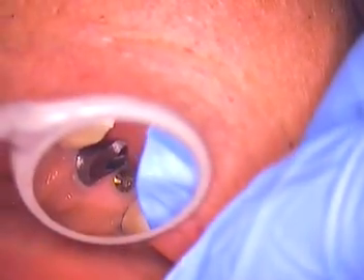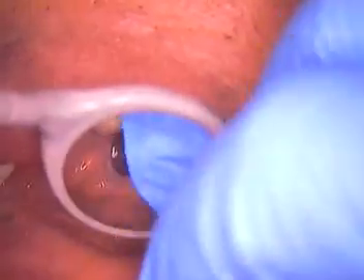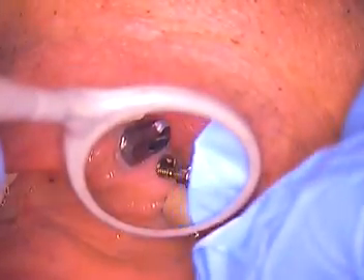Let's go right to putting the next abutment in, and then we'll try in the crown separately. And then we'll be finished with the trying. So out comes our little guy. Here we go.